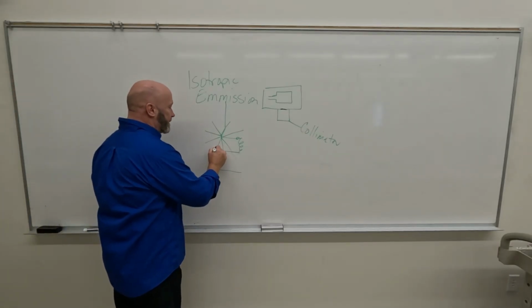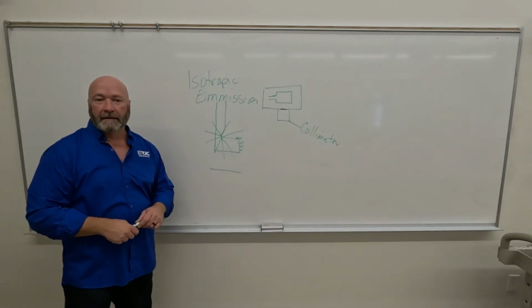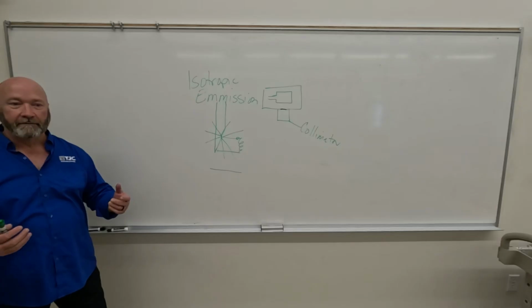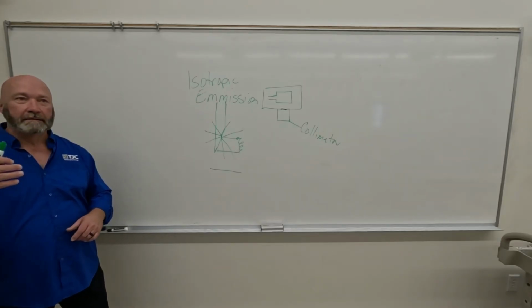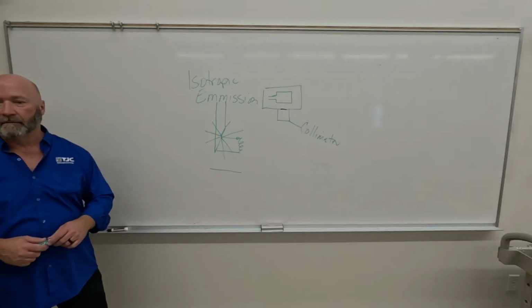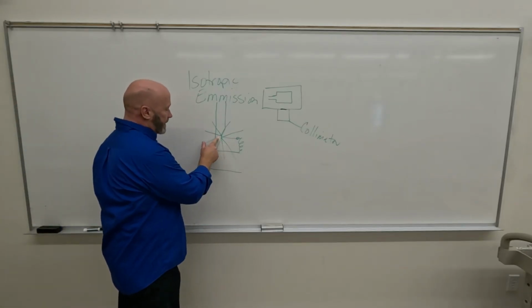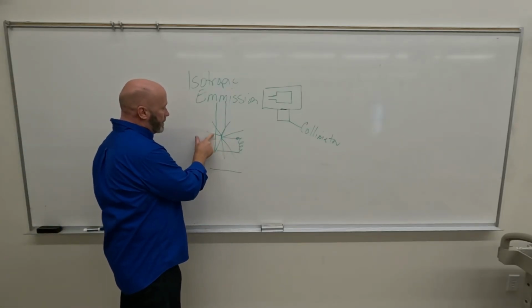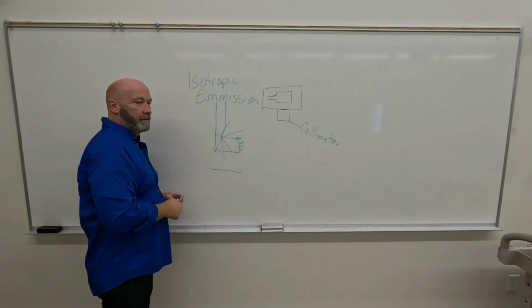Okay, so what did you notice about the anode when I passed it around? The big disc. It's heavy. Why is it heavy? It's made of metal, right? So what shows up real well on X-rays, better than anything else? Metal, right. So the likelihood of these X-rays going through the anode, very, very good?